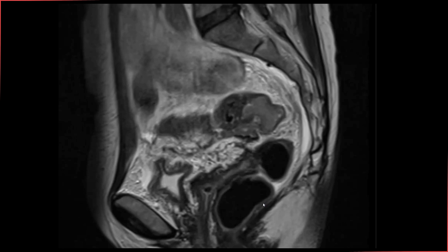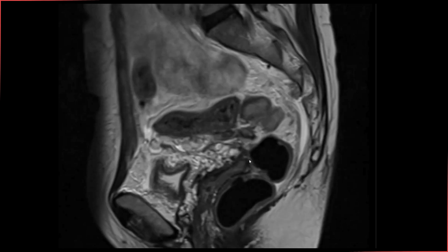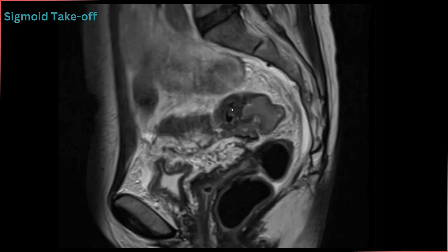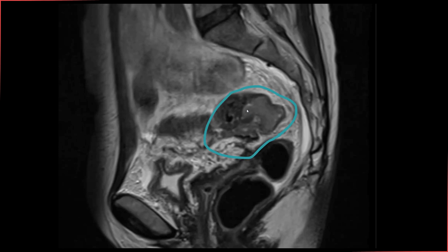Just to give you a quick review — if you remember, we talked about the sigmoid takeoff, which is the point where the sigmoid colon moves ventrally away from the sacrum. You can see there is some intermediate signal soft tissue thickening just below that sigmoid takeoff, probably extending partially into it as well. This is the site of the tumor, involving the upper rectum as well as the rectosigmoid junction.